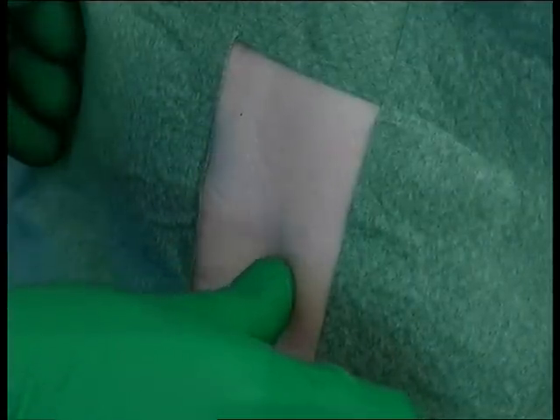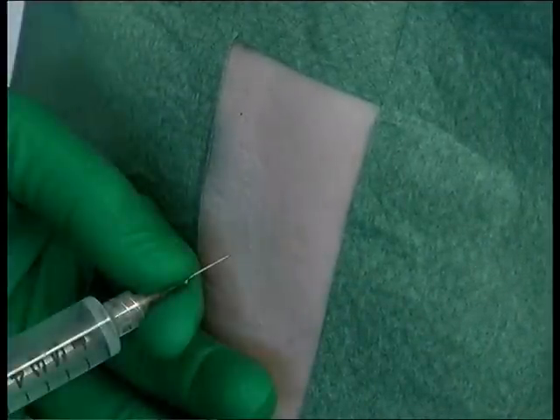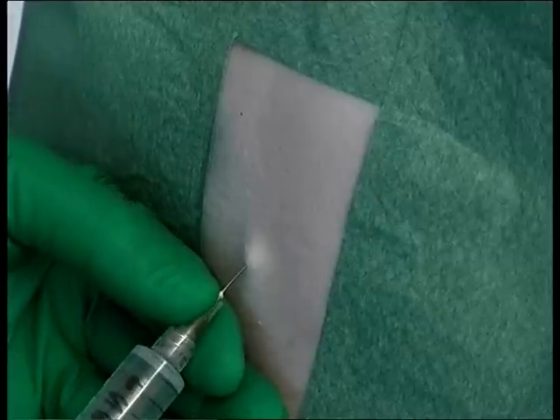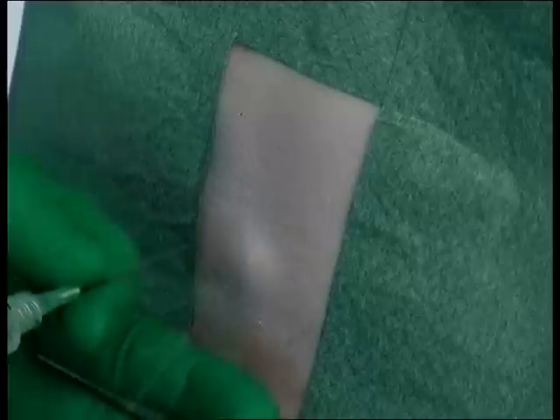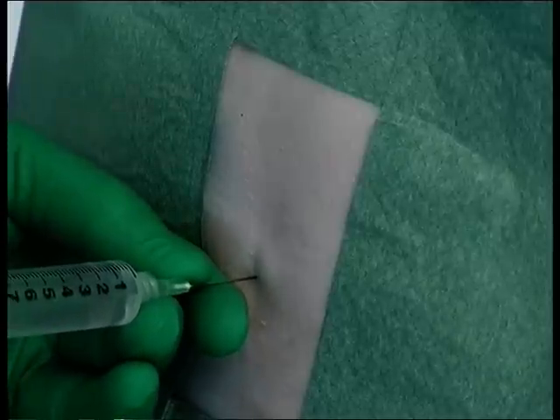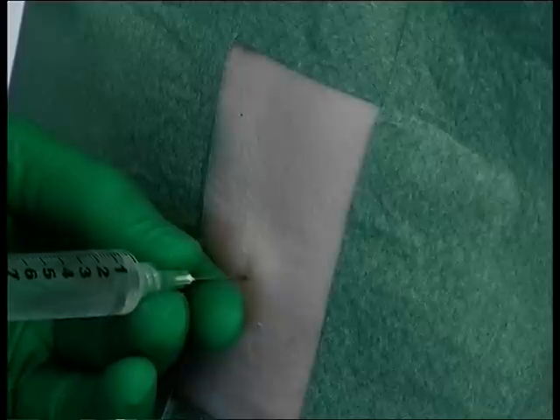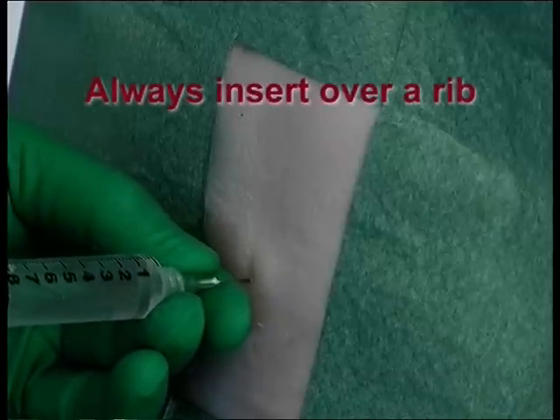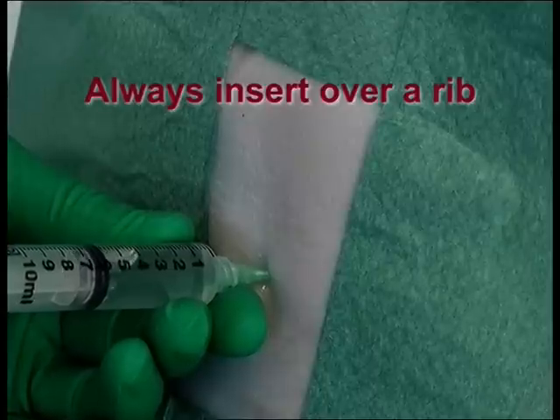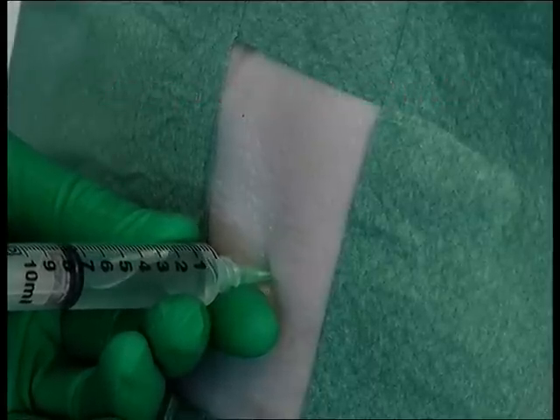The area should be cleaned with an approved antiseptic solution and draped appropriately. Supporting the needle with one hand, infiltrate the skin and subcutaneous layers with local anesthetic. Aspirate during infiltration to avoid accidental injection into a vein. Entry into the pleural cavity can be detected by sudden aspiration of air. Note the depth of entry.